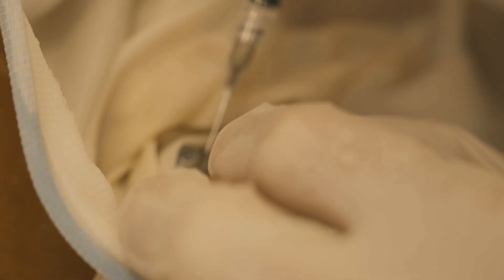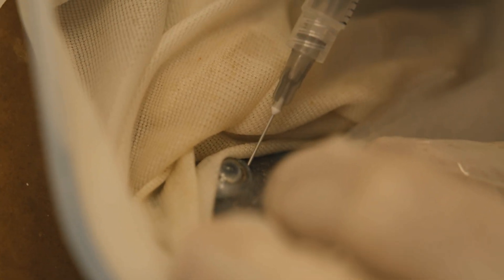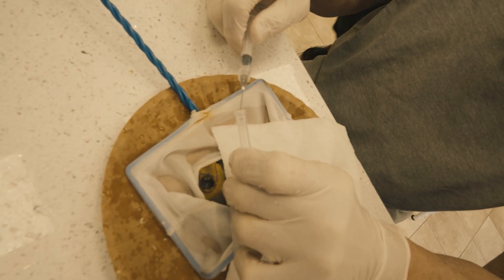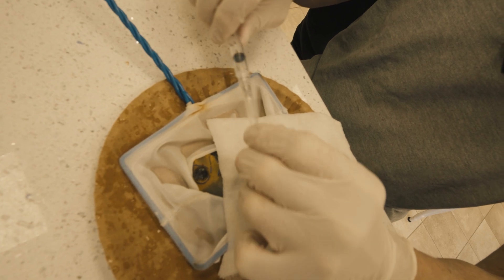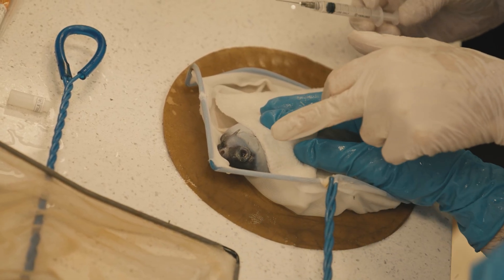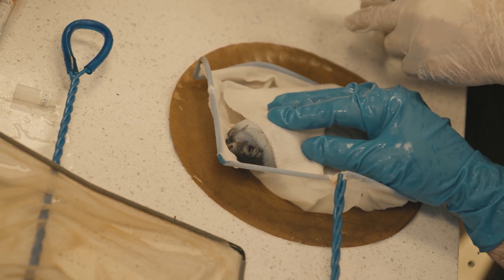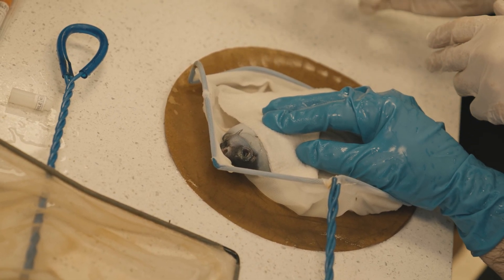I can see it's not in the lens — he pulled it behind it. It's flatter. That was gas in there, that was gas. Does that give you any clue? It does — yes, we're going to plan B.